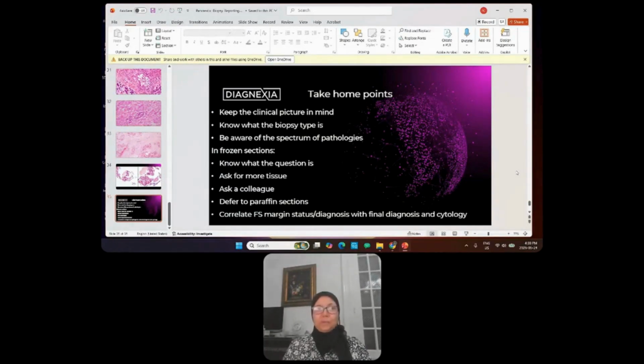All the points you raised about frozen sections are really most helpful. And I wanted to ask you, where you practiced, do you have a certain protocol or requirements that the surgeons include in the request form and pre-information to the lab prior to submission of the specimens, or do you just get a phone call saying, we've received a frozen section on a pancreatic?